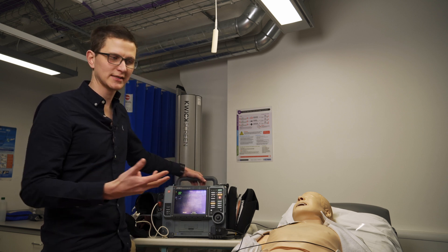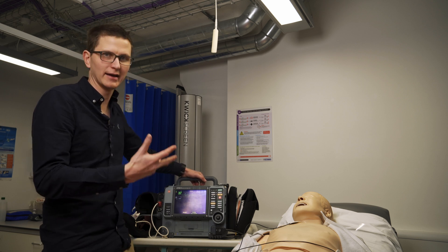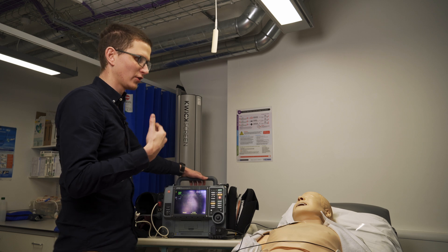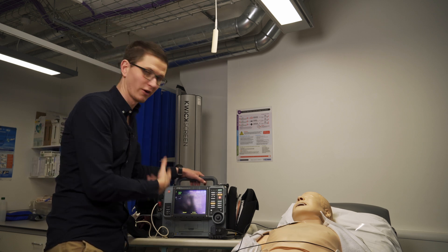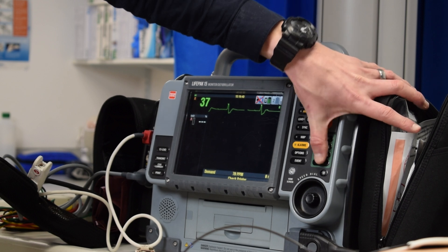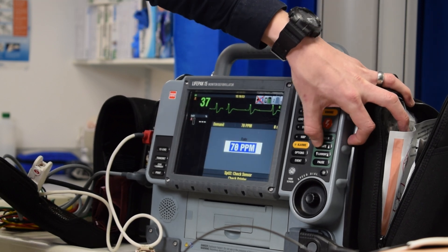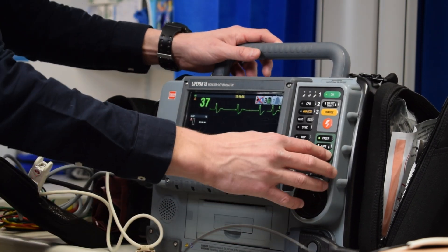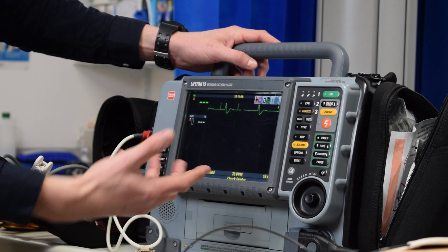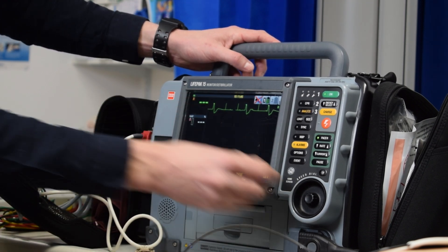Demand is quite safe and is what we'll typically do, unless we're in something that's moving like a helicopter or plane where the ECG will be distorted — in that case we'd use fixed. We're happy with our rate of 70. Now we're going to increase the current. It's important to notice that once we increase the current to 10 milliamps, which is the least amount, we can see our pacing spikes appear on the ECG.